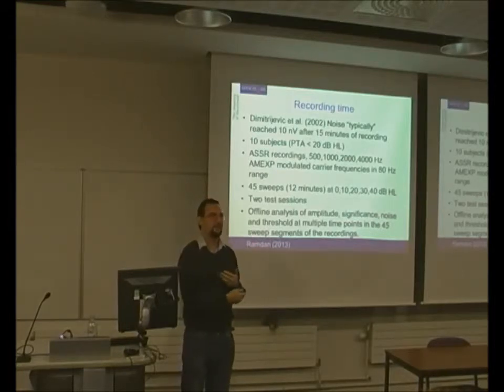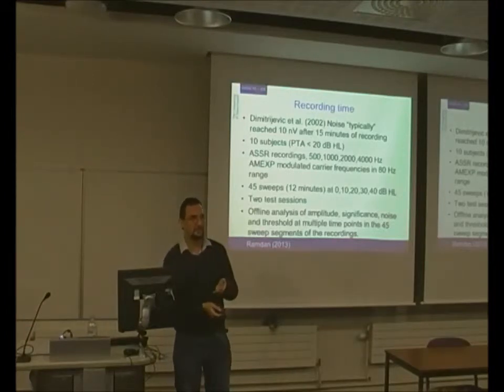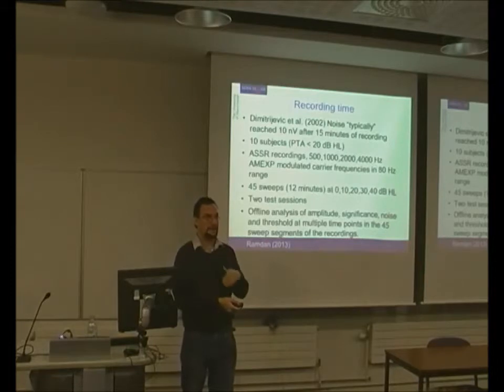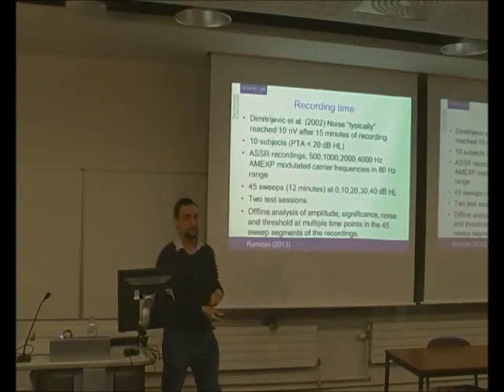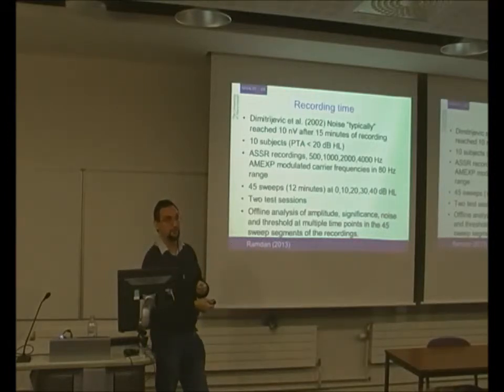So we'd say, if you stop the recording at 15 sweeps, what's significant reach there? And then 17, 23, and so forth until you got to 45. So allowing it to run to 45 sweeps for a recording to pop up. And of course, the longer the recording, the less the noise was. So there was a greater chance of the small responses closer to threshold appearing.